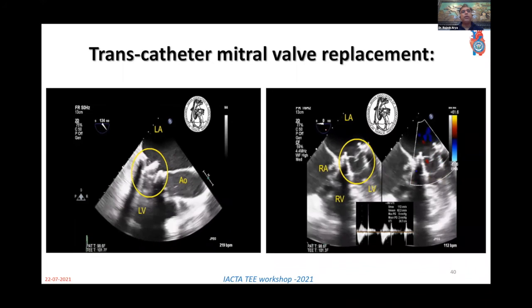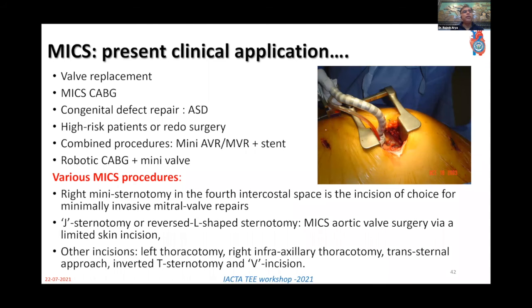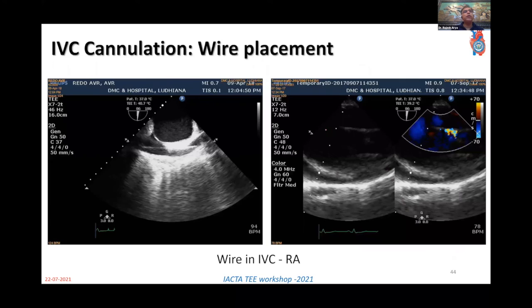Now, coming briefly to minimally invasive cardiac surgery. Minimally invasive cardiac surgery is now very much in routine because we need a smaller size of incision, good healing, less bleeding, and all those things. But certain things we must tell our surgeon which prevent the minimally invasive cardiac surgery. I mean, if they are present, the MICS is not possible. These are enumerated here. So let's quickly go one by one.